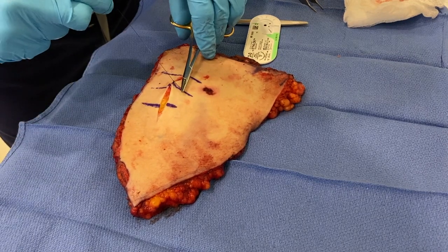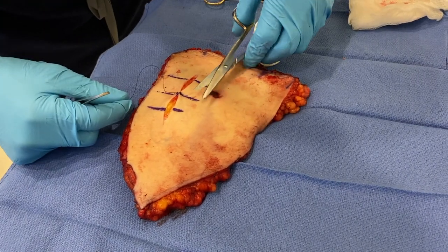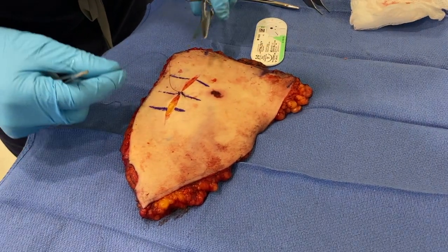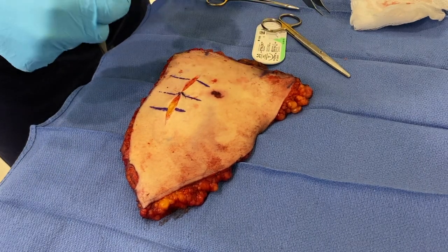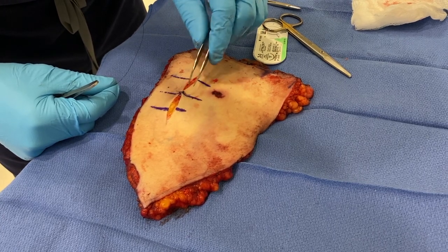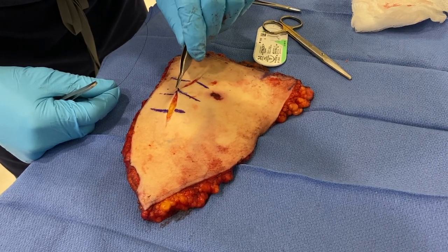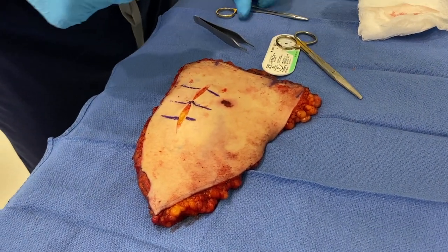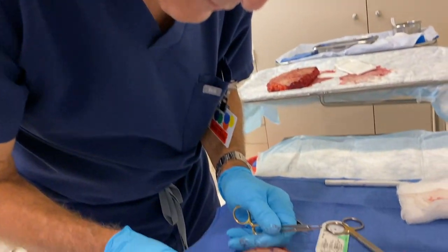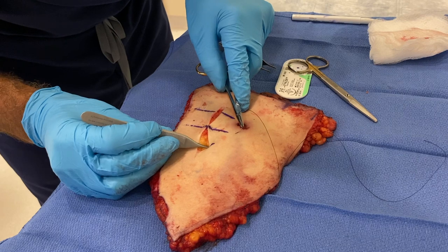This is Ethilon — or nylon, black nylon — a monofilament suture. It will tend to unravel like most monofilaments, so if you're using a monofilament you want extra knots. You can see how that everts your skin margins. Make sure there's enough distance between your first and second pass so you can get a scissor in later to remove that stitch. If it's too close it's going to be too hard to take out. Also, don't make it too tight — you don't want to strangle the tissue and end up with hash marks.